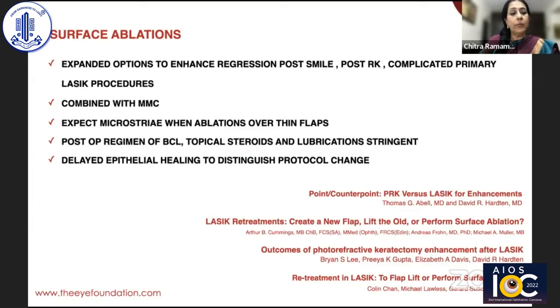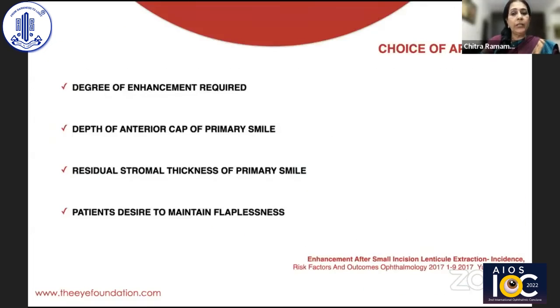And I think we should remember that you could expect microstriae when you're ablating on a thin flap. And even in the post-op regimen, if there is delayed epithelial healing, you might have to leave the bandage contact lens for a longer time and use more lubrication.